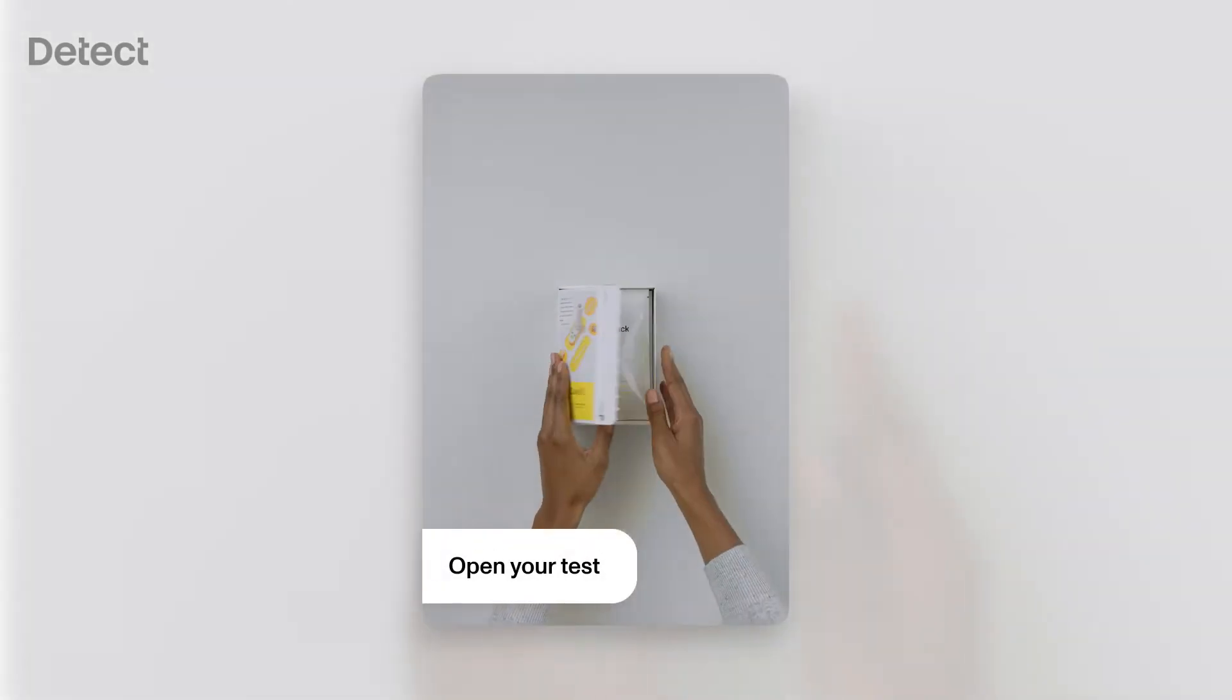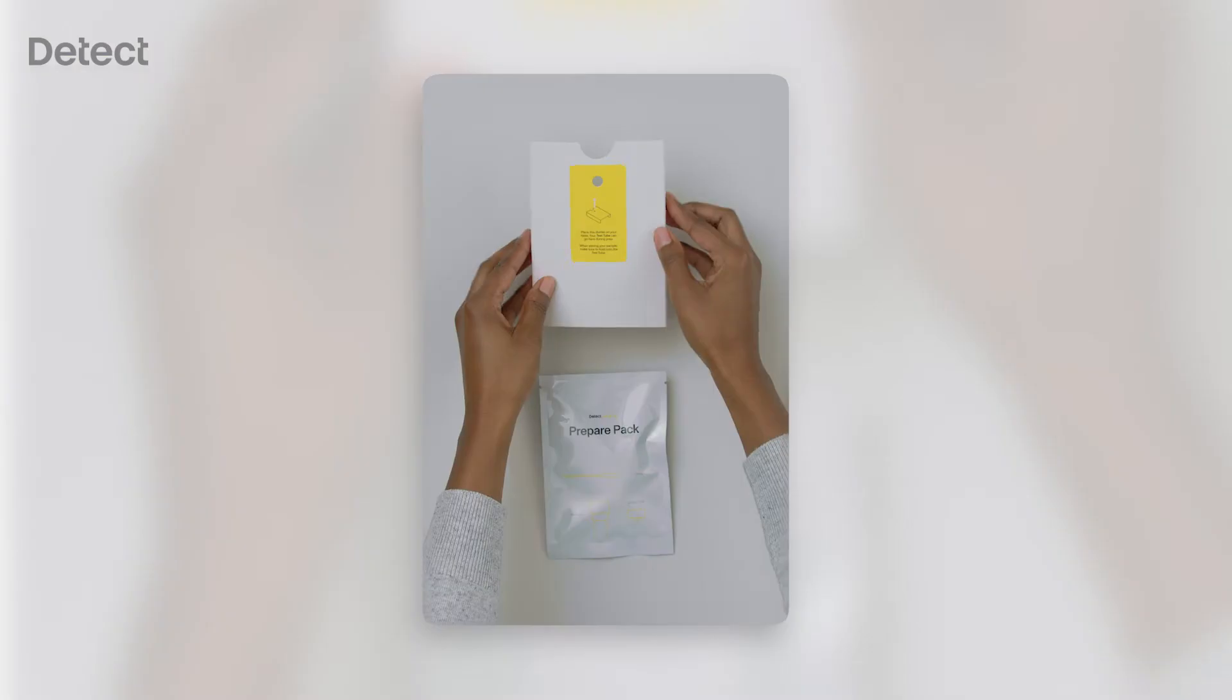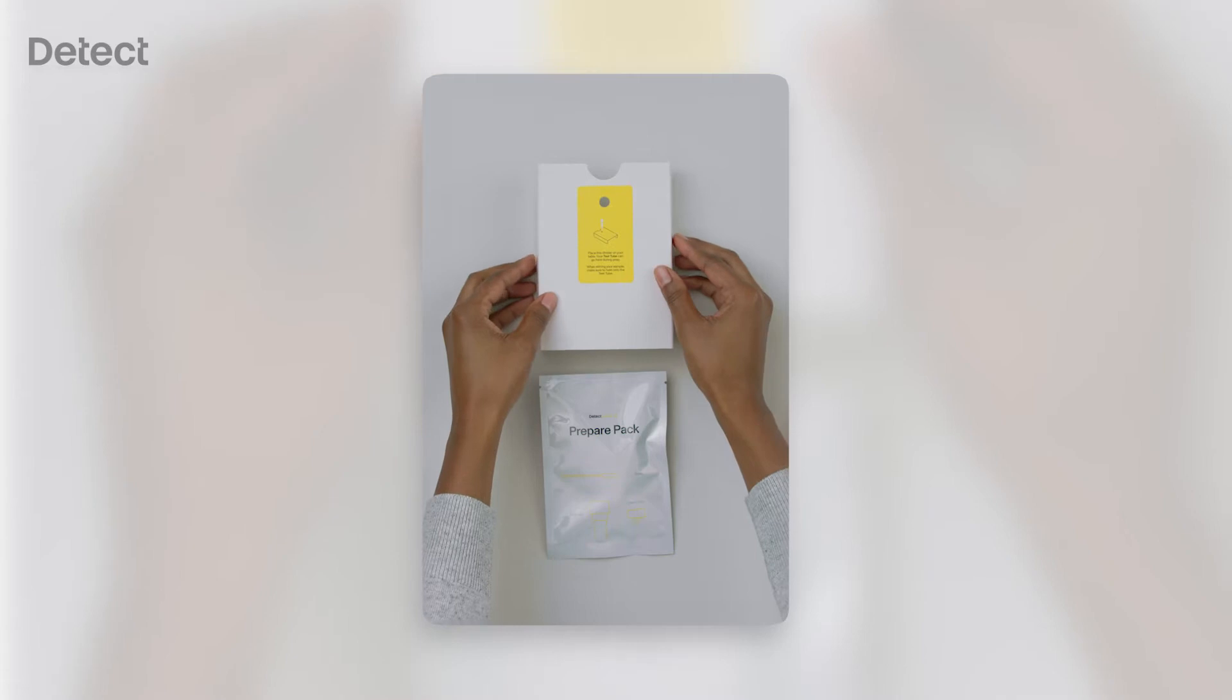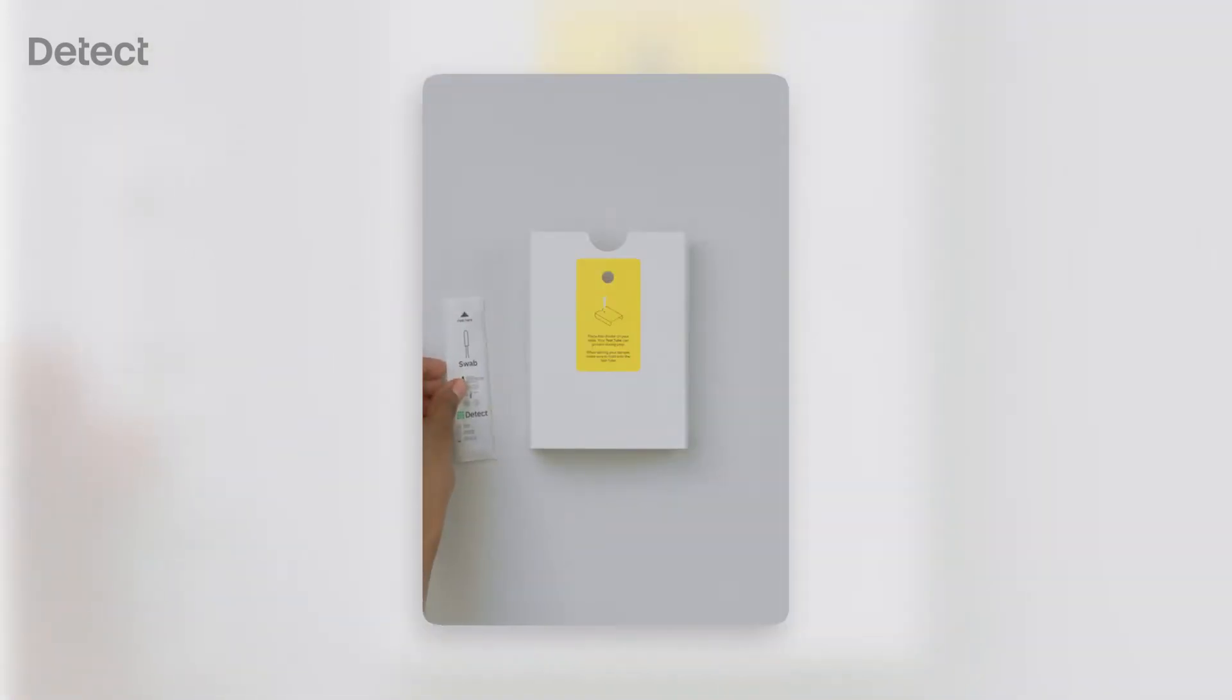Open your Detect COVID-19 test. Take out the Prepare Pack and set the cardboard divider on a flat surface. Open the Prepare Pack, remove its contents, and set aside the pouch labeled Detect Cap.